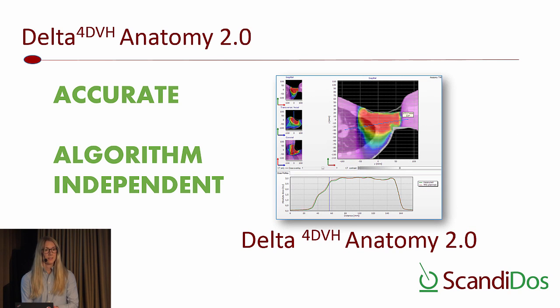So there we have our accurate and algorithm-independent software module, Anatomy 2.0.